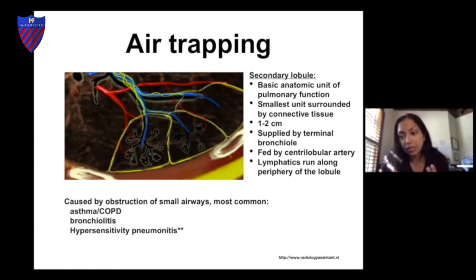Mosaicism, just so y'all know, can also be seen when you have heart failure, like too much fluid on your lungs, or in pulmonary vascular disease like pulmonary hypertension. So in and of itself, it's important to understand that the radiology alone is not the Bible. It's a hint. The doctor has to take that information and put it in the context of everything else going on.